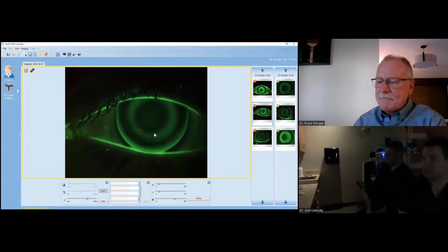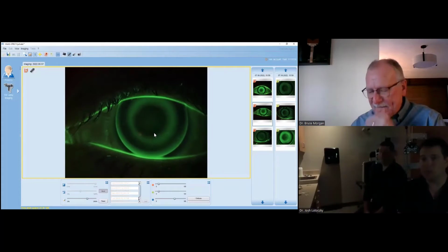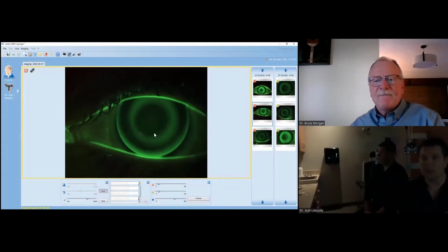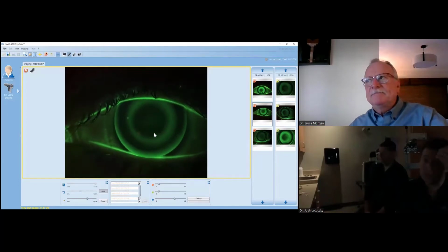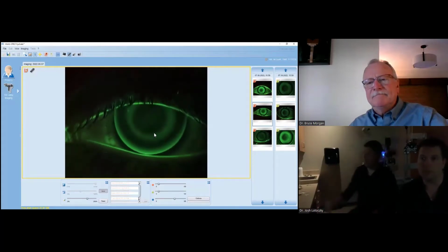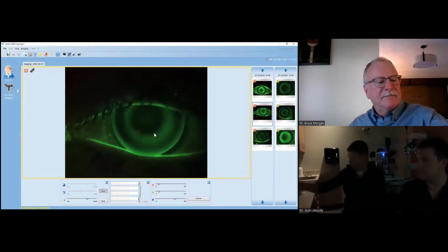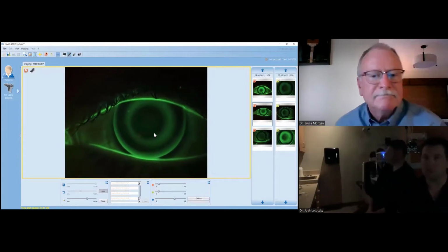And it goes back to the comment that I made earlier. I personally don't believe you can do Ortho-K well without a topographer, because that really is what's telling you what's going on. You can do a lot of Ortho-K dispenses and one-day visits, but if it's not going well, then where do you go from there? So that's where the topographer really is key. And it could show you that something like this actually is fine and works really well for the patient.